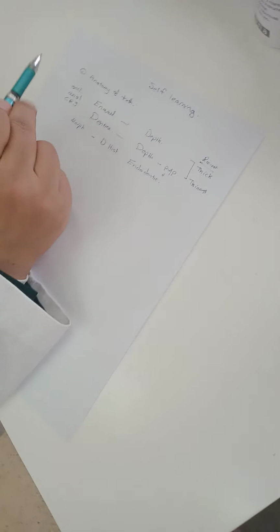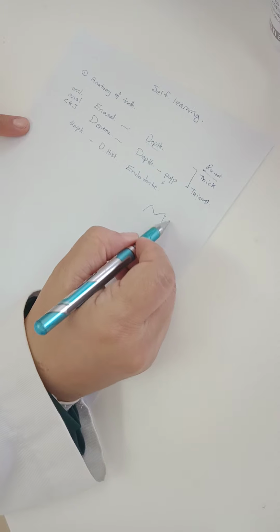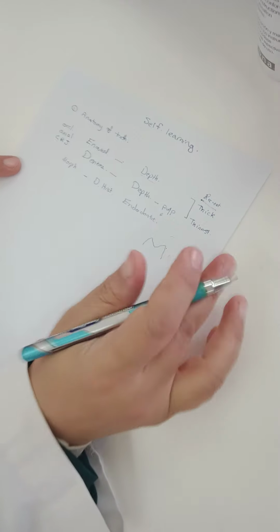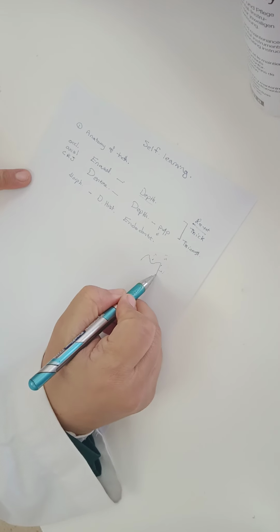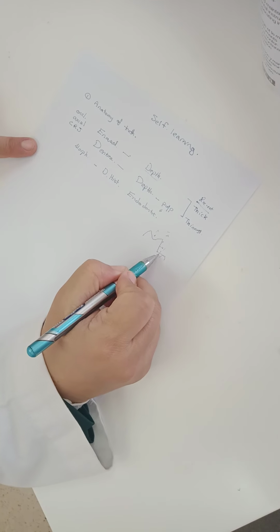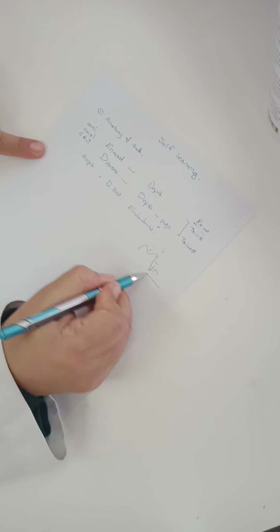Dentin is the same. The pulp chamber has a different morphology. You know the morphology of the pulp chamber, so that morphology leaves us with a different thickness of dentin around. So you're going to look at occlusal, horn thickness, and axial, close to the gingival margin. And we know that the cement-enamel junction is deeper than the gingival margin. So this is my first task.